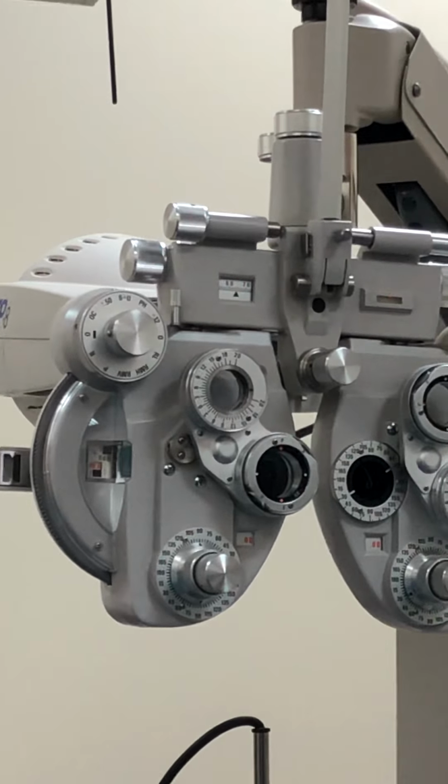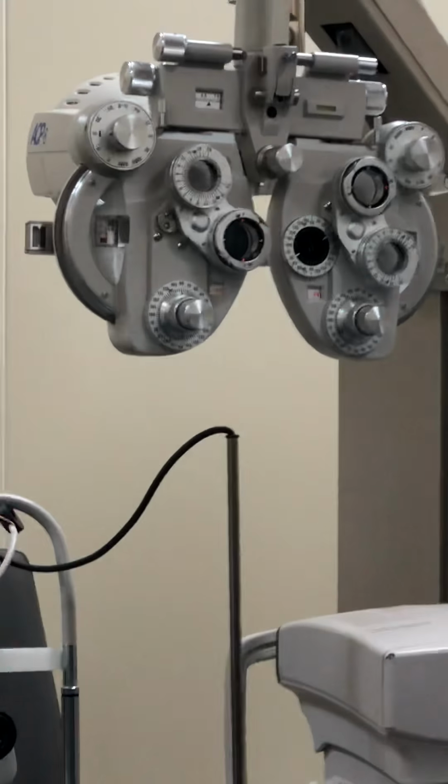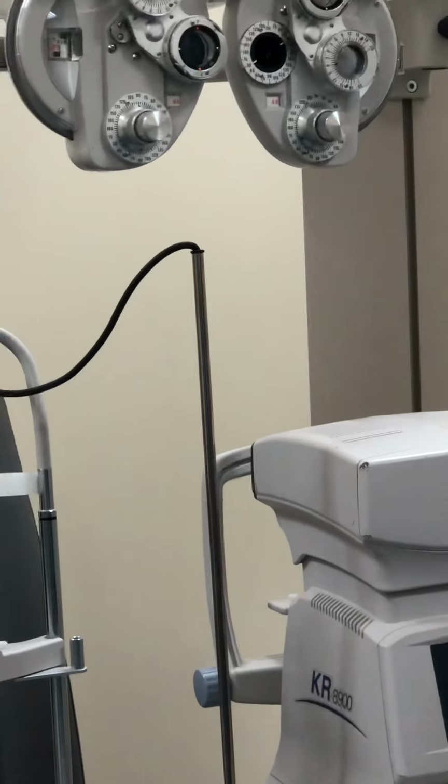Ask the patient to compare, with the refraction correction, the upper one and the lower one, which is better or whether both are the same.